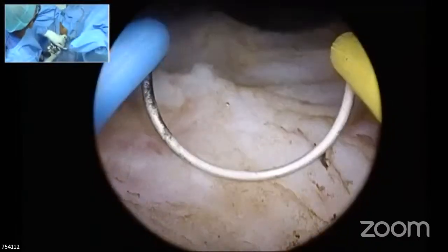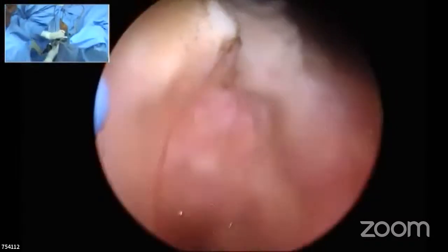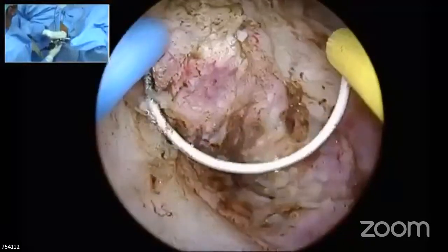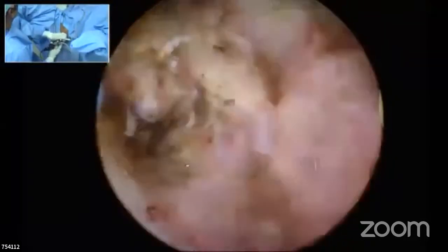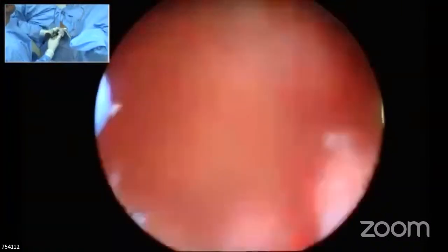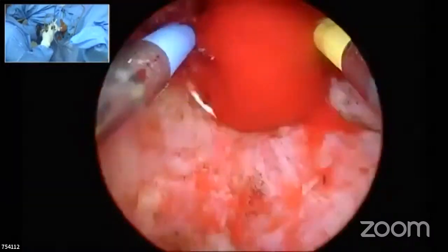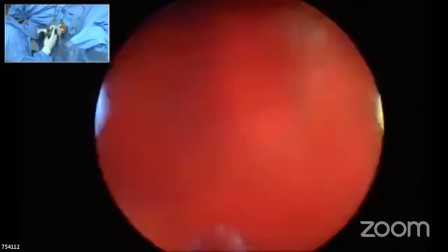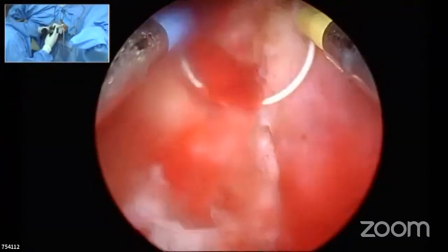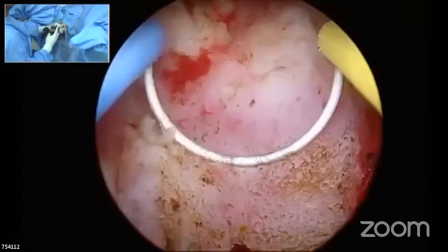Your comment on that, sir? Agreed. I agree with you. Always at the end, you must look in again before you take out your sheath, and you distend the bladder. So when you take out the sheath, there will be a good flow of urine. You can assess the result on the table also. Yes, sir. At the same time, the advantage of that is actually more than the flow. The advantage is if there are small chips in the prostatic fossa, they get cleaned off. These clots will come away along with the flow initially, sir. That's the reason why we need to do that, sir.